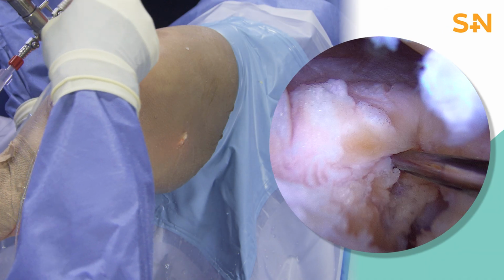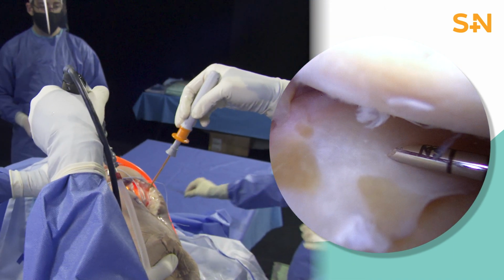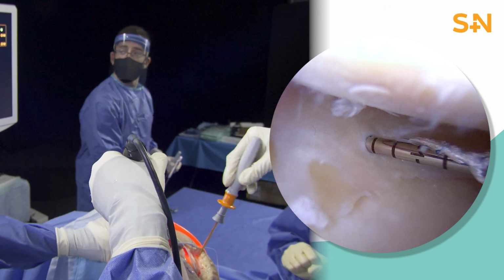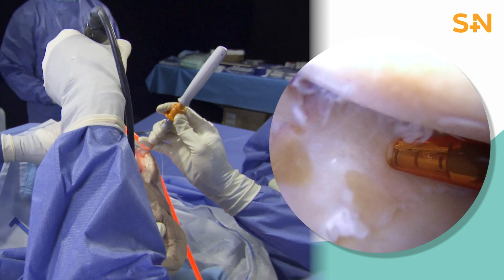A probe can be used to displace the posterior medial capsule from the posterior medial meniscocapsular attachment. A ramp lesion is diagnosed if a tear or separation is present at this junction. Multiple techniques can be used to repair a ramp lesion. In this case, we will demonstrate a repair using a FAST-FIX Flex.